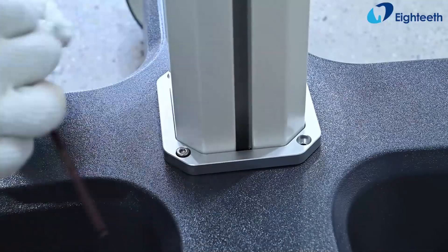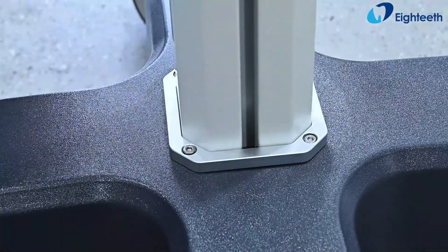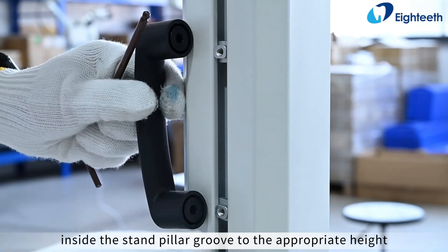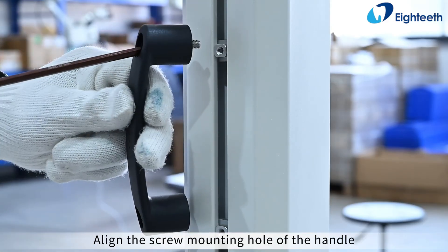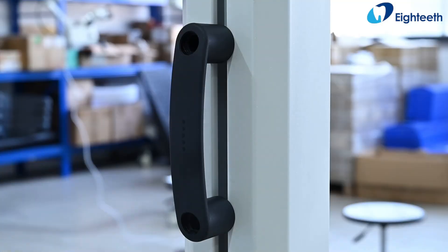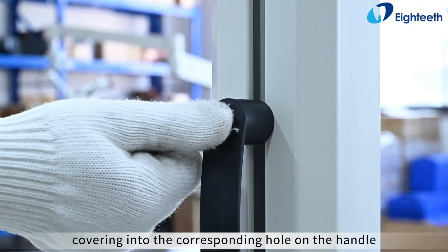Take out the handle and move the handle mounting block inside the stand pillar groove to the appropriate height. Align the screw mounting hole of the handle with the corresponding screw hole on the handle mounting block and secure it with screws. Then press the screw hole covering into the corresponding hole on the handle.